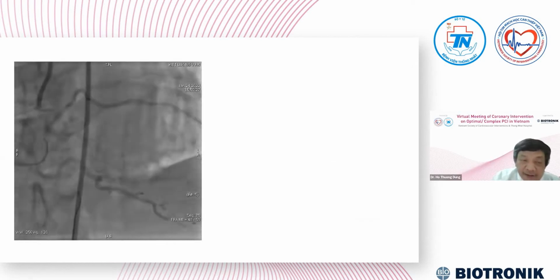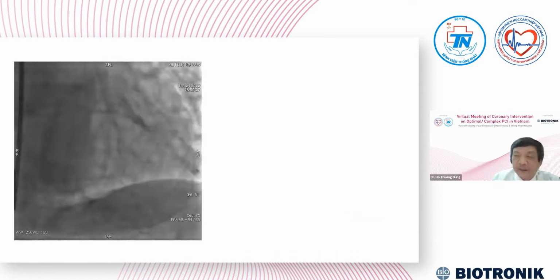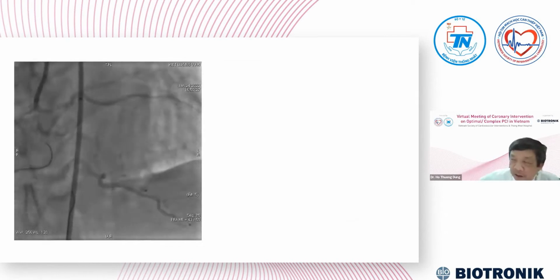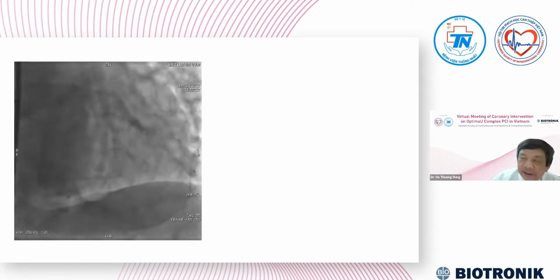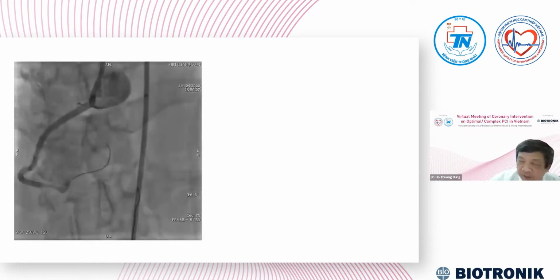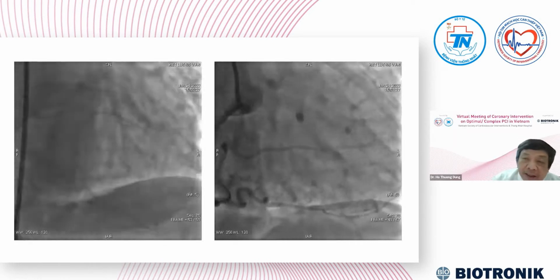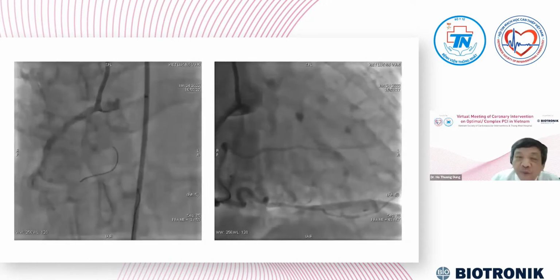And I think that the distal stent is a little bit short, but I think it's okay because at this time we don't dare to push the stent further distally. I'm afraid that after we do the first stent, the second stent cannot get over the curve. So we must pull the stent back a little bit, so you can see the remaining lesion. But I think the collateral blood flow improved very excellently.